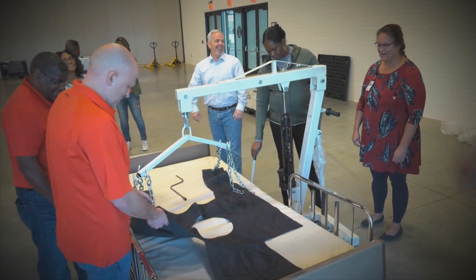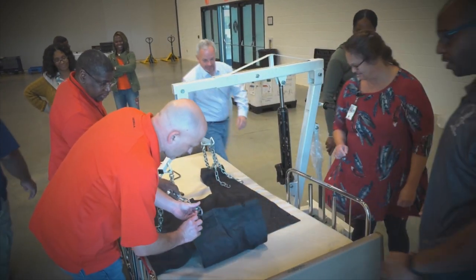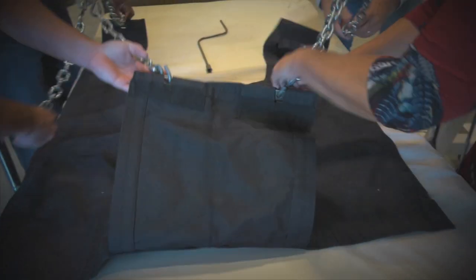A patient sling is included in the set and should be placed under the patient. The six hook chains of the lift device are attached to the sling's six lifting points.